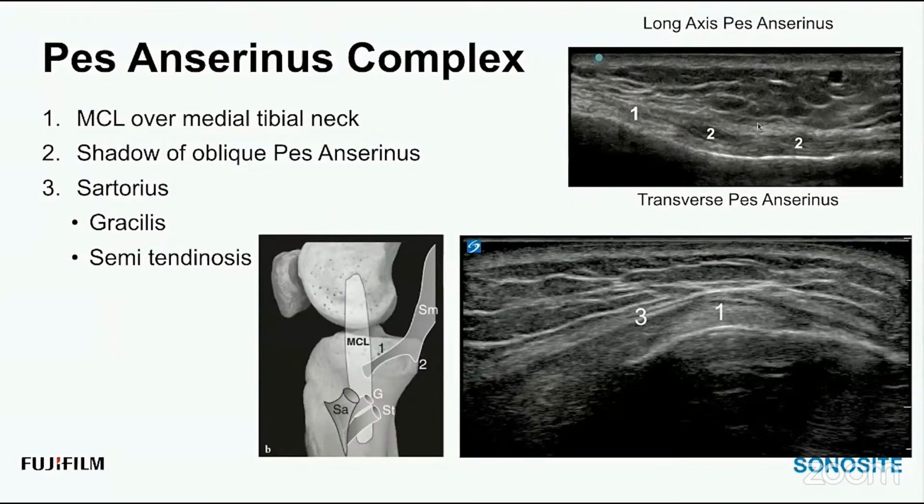These are not pes bursa, and it's sonographically rare to see a real pes anserine bursitis, and you really only catch them a couple of times a year, even if you're scanning a lot of knees. You might only see one true pes anserine bursa over a period of 5 years. They're just sonographically extremely rare, so don't get disappointed. But what you're going to find a lot of is tendinopathy.